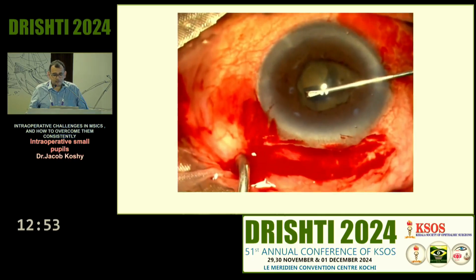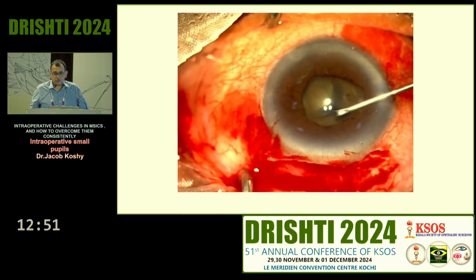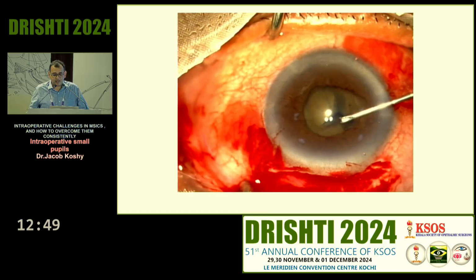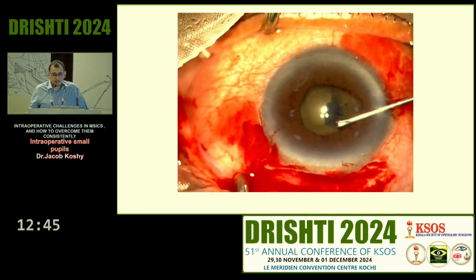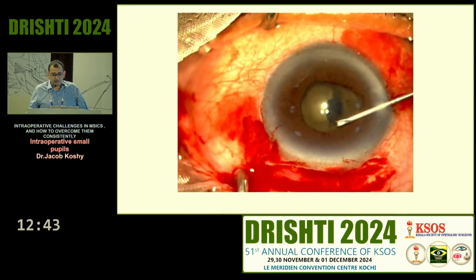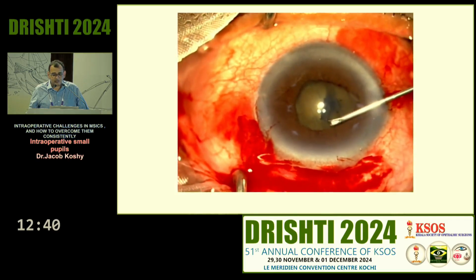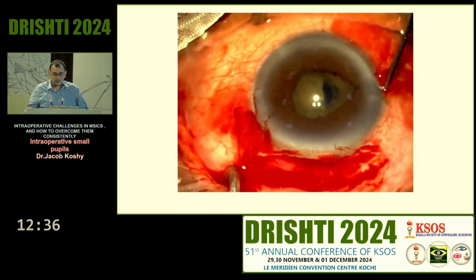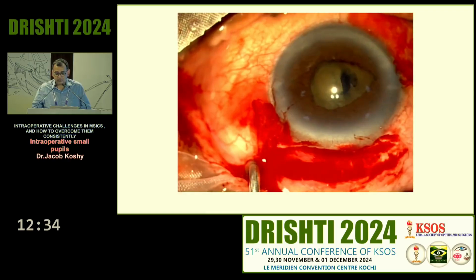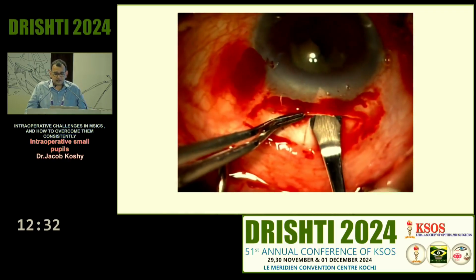I think I'll start off with the rexis. Now, many of the times you have to do a blind rexis, where the tearing edge is just under the pupil. You can't see it clearly. And I think it's going well. And at somewhere around this stage, I realized that no, it has run off to the periphery. I'm trying to make some cuts to rescue it. Now iris has started coming out through the side port. I thought, okay, leave it.